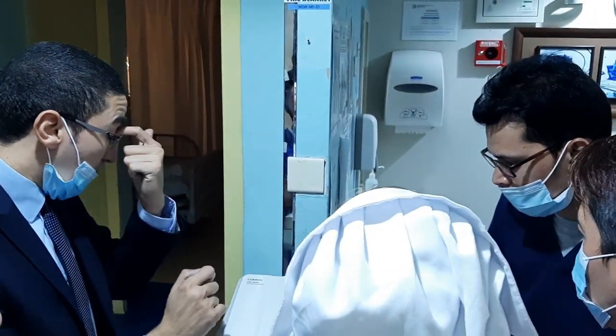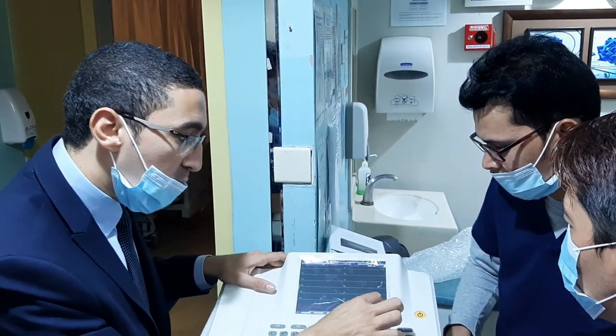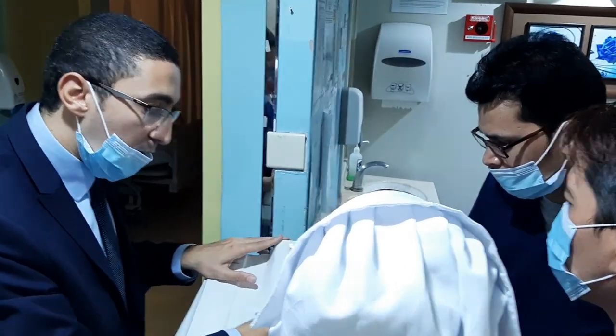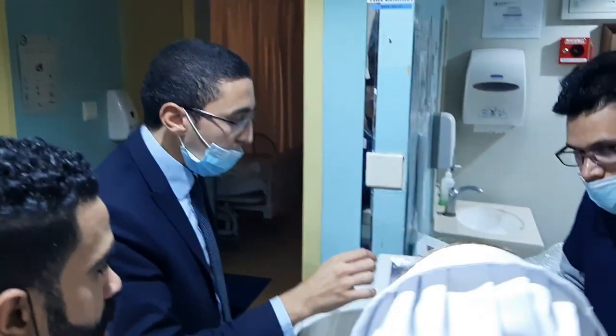Okay, good. Now I will show you how to change the date. From date and time, date and time from system. Very easy, touch screen. Here, 10 November. About the time, adjust the time.